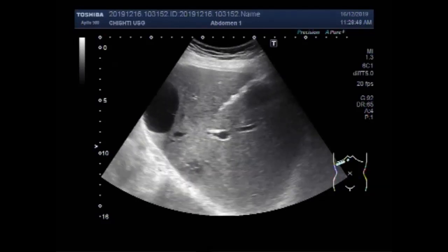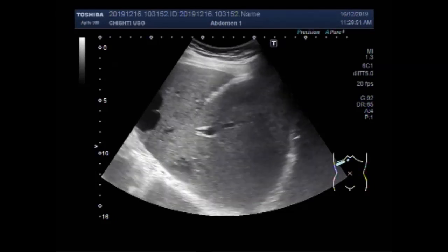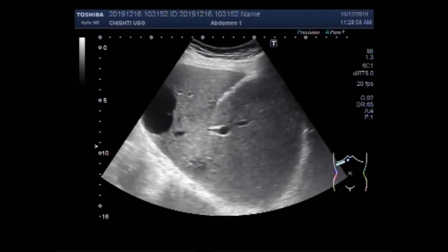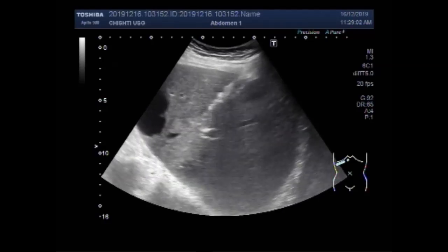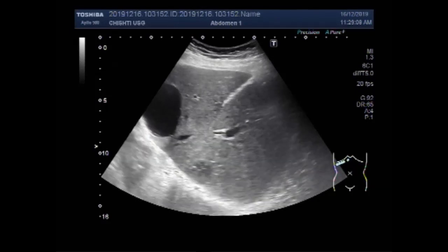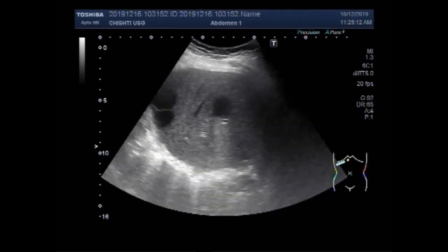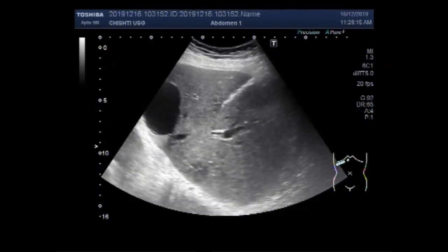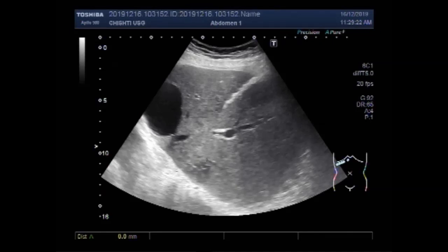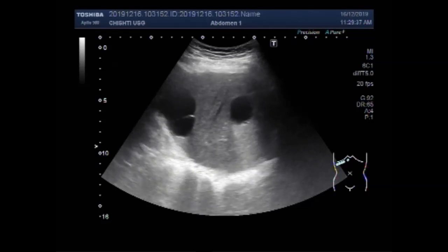Now you can see a small mass is also seen in the lower portion of the left lobe of the liver. This mass measures about 2.3 centimeters by 2.3 centimeters in diameter.